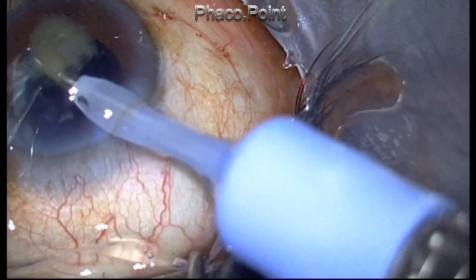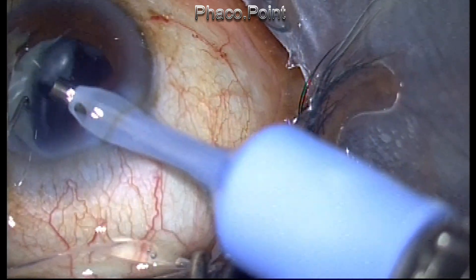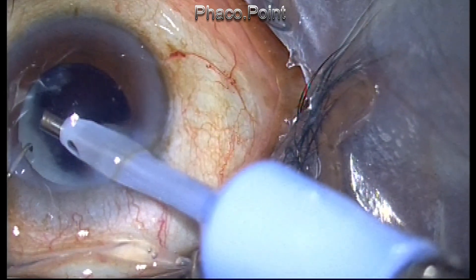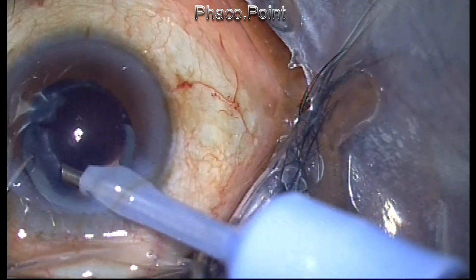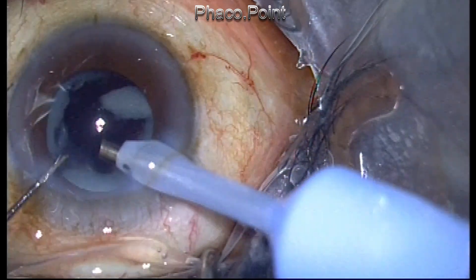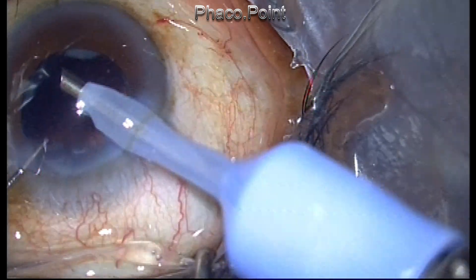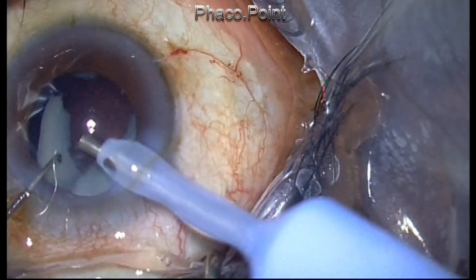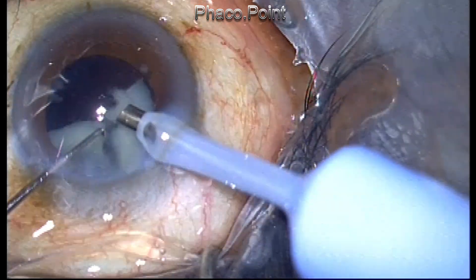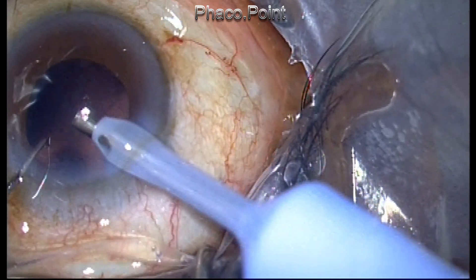The nucleus has been successfully emulsified, and while trying to remove the cortex I find that it is solidified. So I stay in the center and do the phaco twirl. See how I turn the phaco tip right in the center — this sets up convection currents in the anterior chamber, drives the pieces towards the phaco tip, and within no time the solidified cortex is cleanly and easily removed.